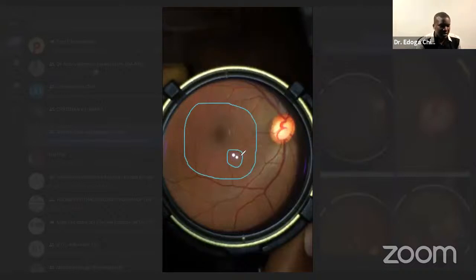So the one reflected at the anterior surface is this, and the one reflected at the posterior surface of the condensing lens is this. It's difficult to remove these light artifacts. But what I've come to understand is that if, for instance, in one of your images these two light artifacts are blocking the macula or the optic nerve, when the patient moves the eye and changes the location, you're able to see the structure clearly and the light will be out of the way.